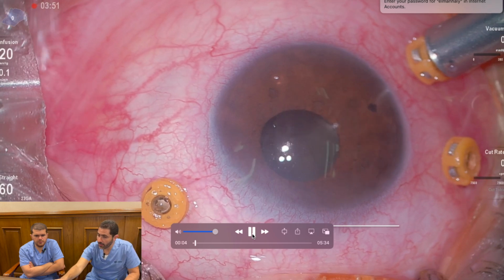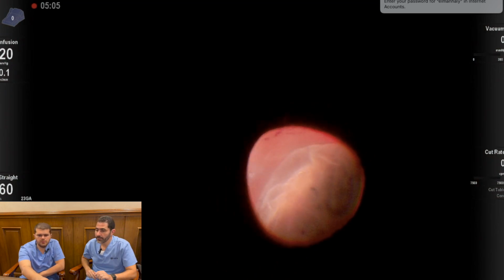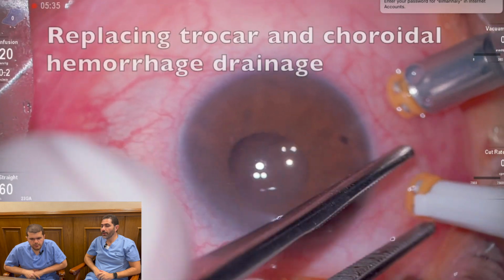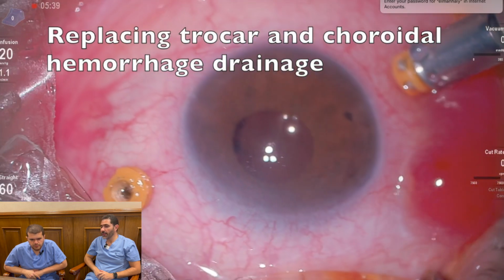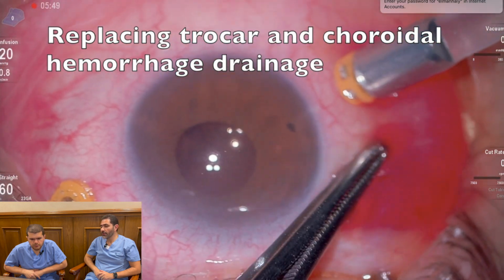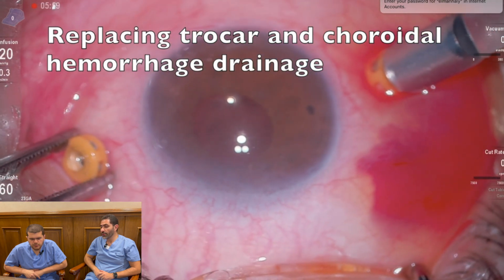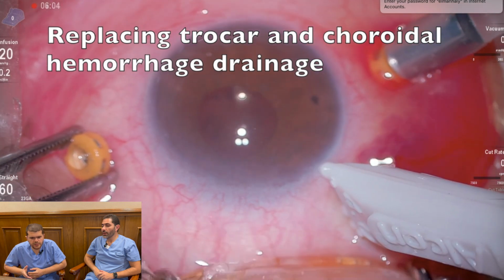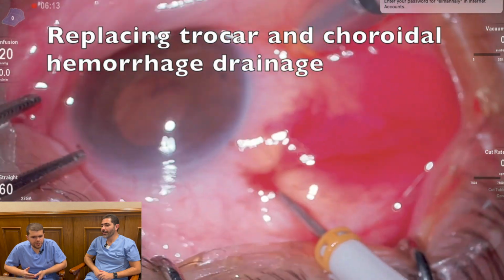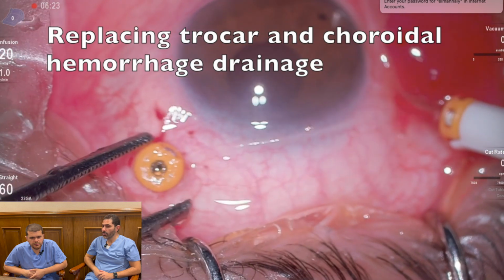The challenge in the beginning of the surgery was to place the trocar, and as we can see, the trocar was introduced in the site of the choroidal detachment, and this is the hemorrhage egressing from the suprachoroidal space. So this is a lucky placement, right? It is beneficial, but it drained some of the choroidal, not all of it.